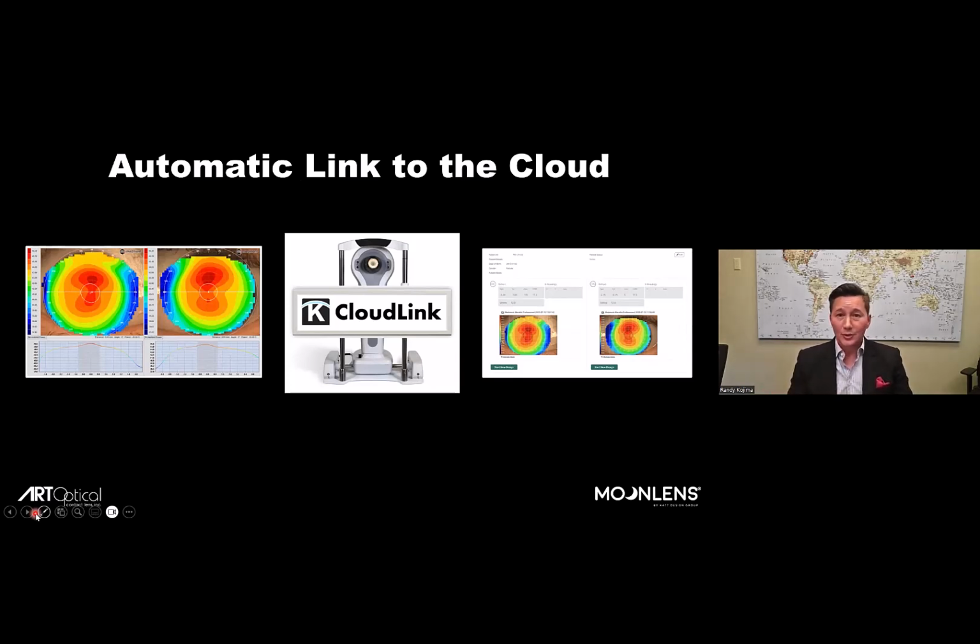And there are specific instruments that do that: the MedMont, the Oculus, the Pentacam, the Keratron, and the CSO. If your topographer isn't listed, it may be coming. You can talk to the art team about it. If your topographer does not link to the KATTCloud, that's okay. You can still enter in the data and calculate lenses.